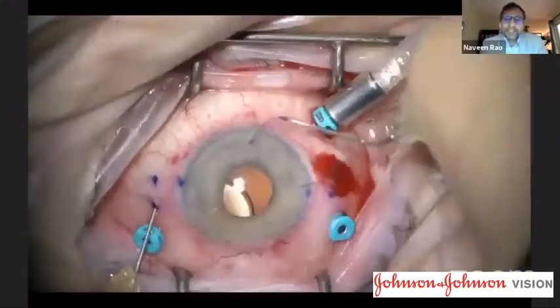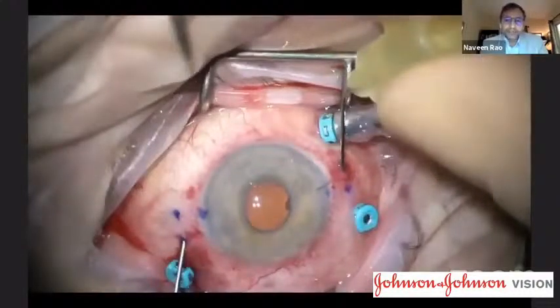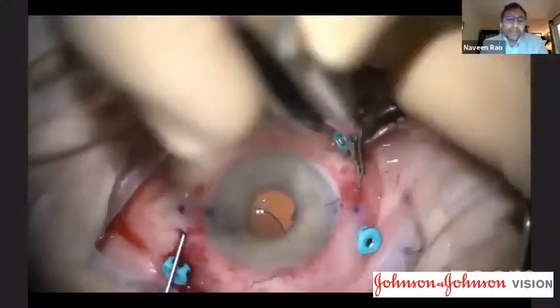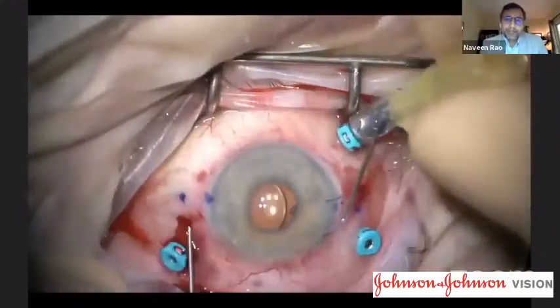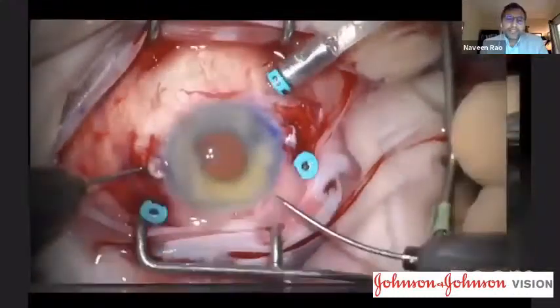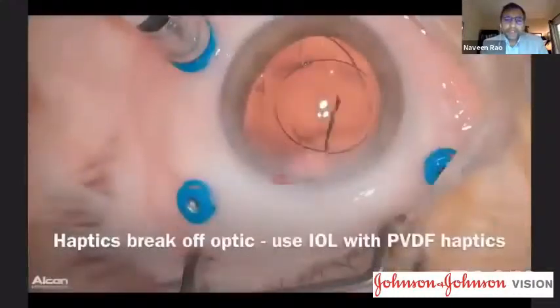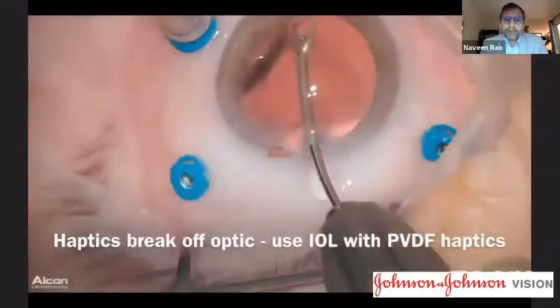So when this happens, again, the only thing you can really do is just take out the lens, start over. Often when you do that, you can still make those needle passes through the original tracks rather than making multiple holes. And sometimes when it's all failing and you don't have the right lens, you just convert to a glued IOL technique. And here's another example of how easily the haptics can break off from the optic-haptic junction.